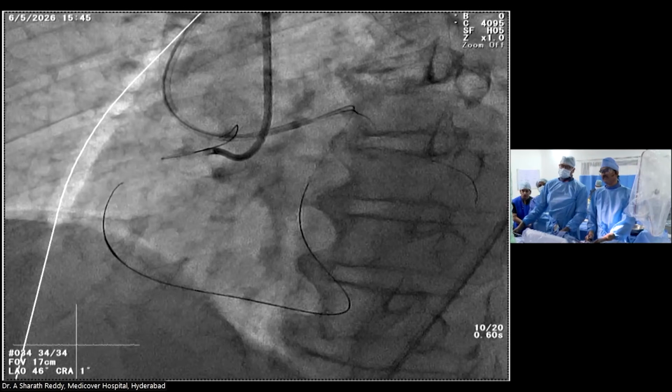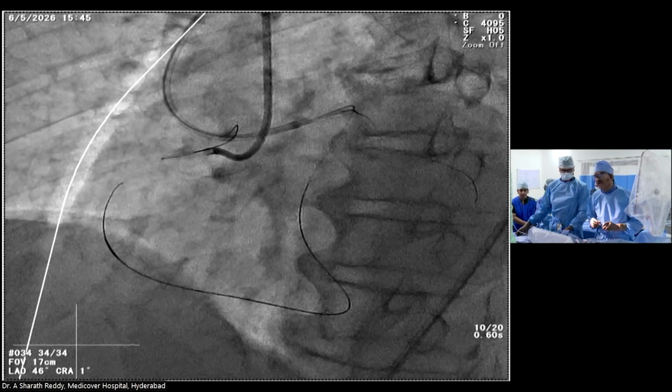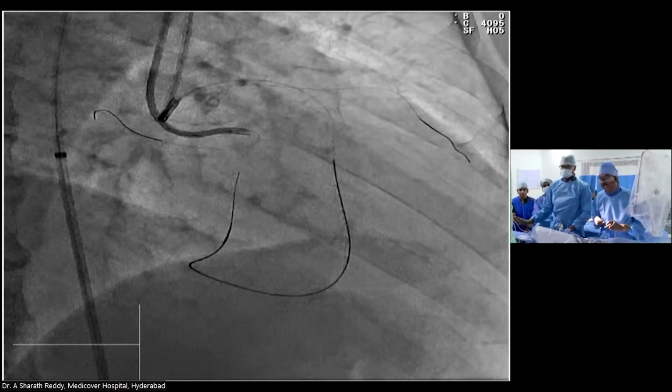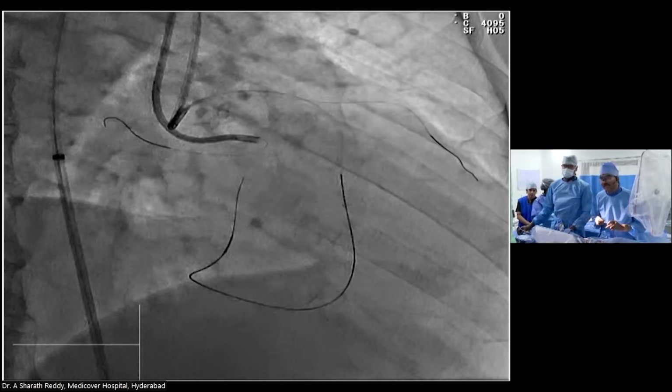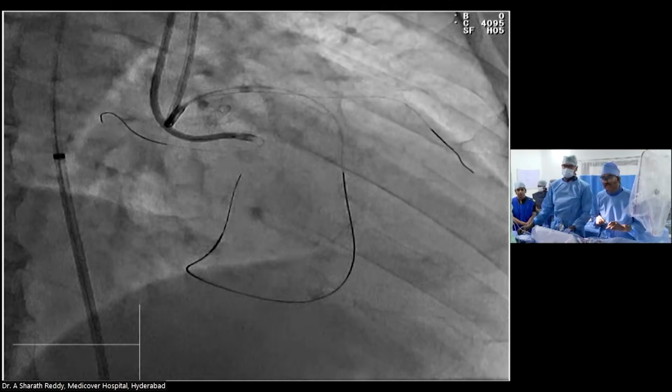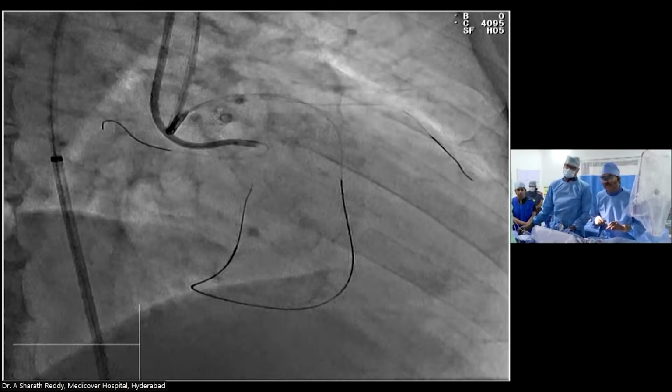Since you have already punctured, or we presume that you have punctured the distal cap, would you downsize your wire? Yes, I'll do that. I just want to get a little up, because otherwise it won't give you great support.